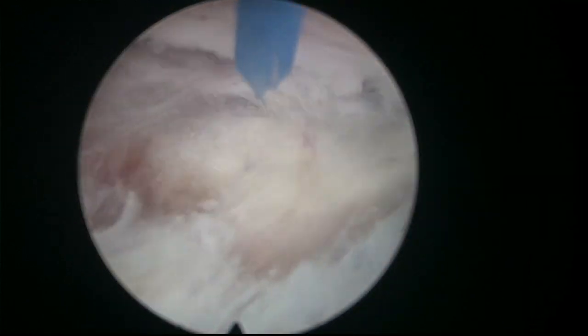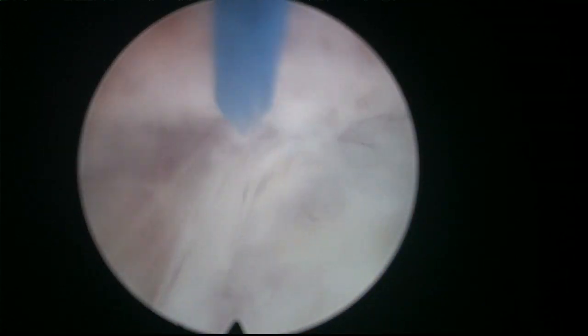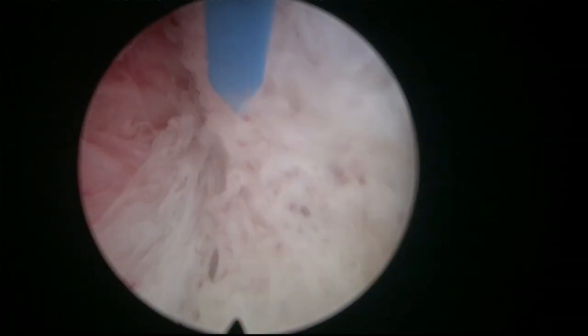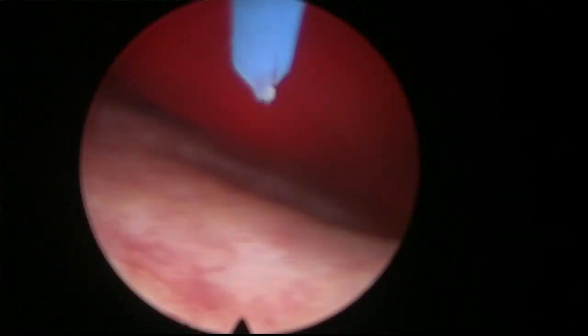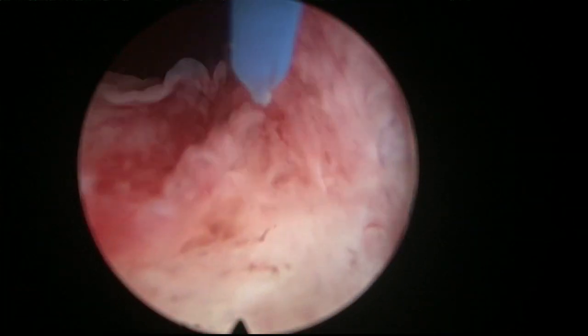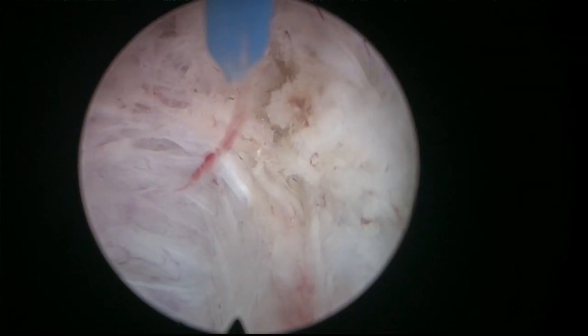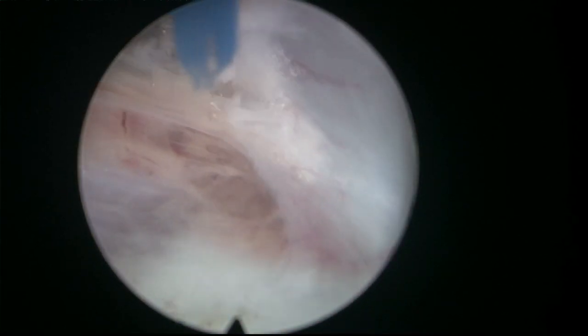Again, stay close to the adenoma. Now I feel the weight of the adenoma on my scope, which means that I need to push a little bit upwards if I want to go in that plane. So what I'm going to check now is, where is the UO in relation to where we are now? Let's see where it is. It was close here. Why? Because I want to cut here in the bladder neck towards the midline a little bit, so I can rotate the adenoma and push it into the bladder, even when there is some remaining attachment at 6 o'clock.